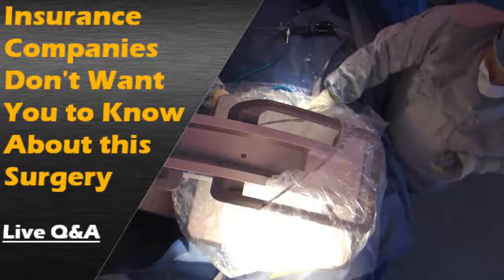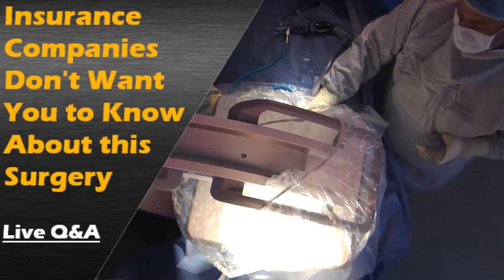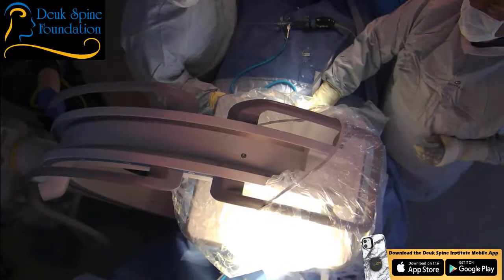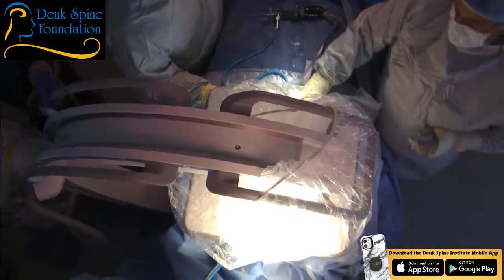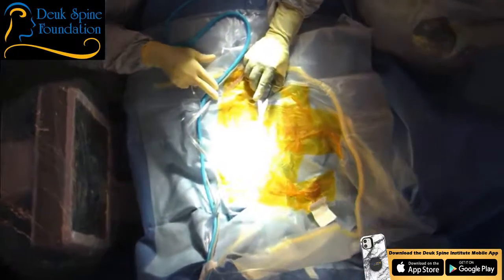Glasses that well. Can you check the rotation on her head, please, sir? And just derotate her. Just do your best. Maybe a little inline traction and a little derotation. Neutral, yeah. And let's do a quick shot. All right, looks good. Go lateral, that's perfect, thank you. We're just to the my side of the midline, which is her right. We're done, you're done. Doctor, you're good, thank you.